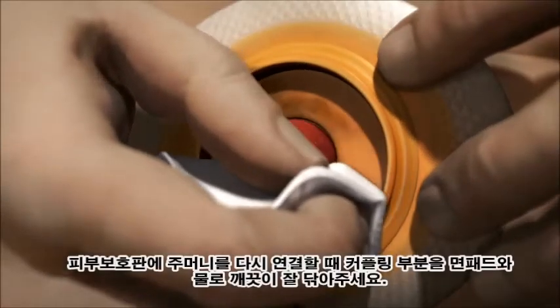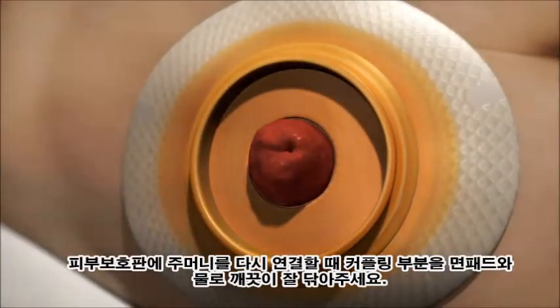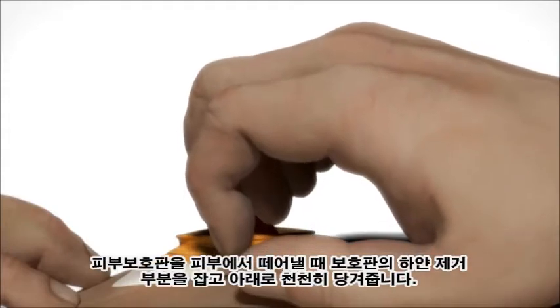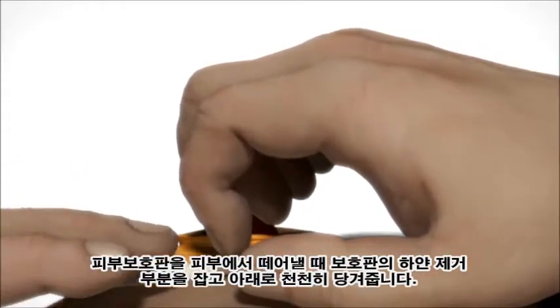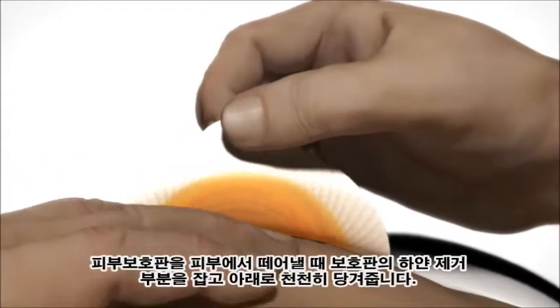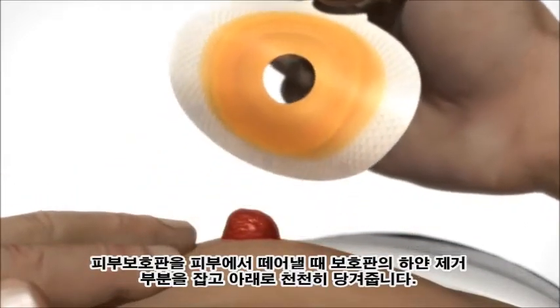If reusing the base plate, clean the coupling area using a cotton pad and water. To remove the base plate from your skin, grasp the white removal ear and pull downwards slowly. Apply light pressure on the skin with your free hand as you peel the adhesive downwards.